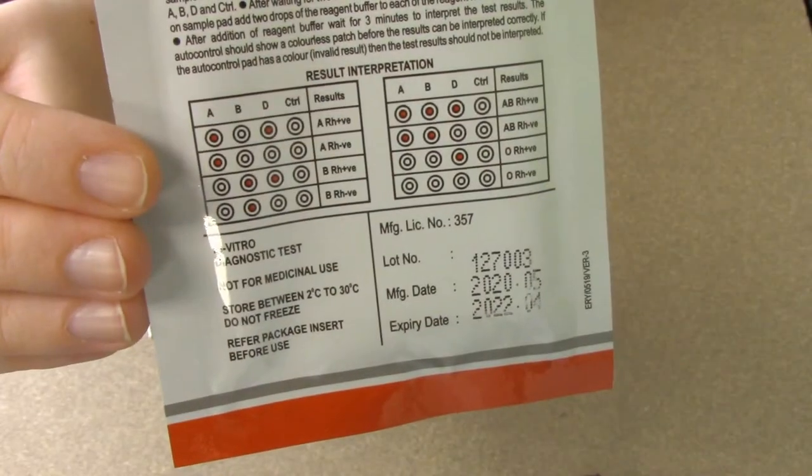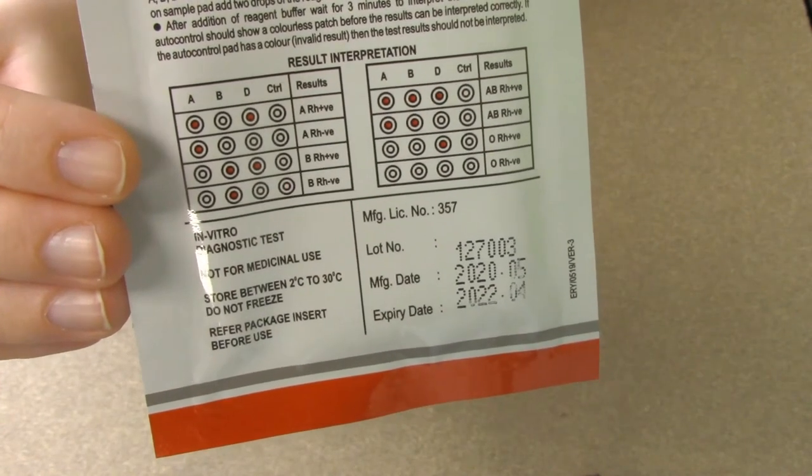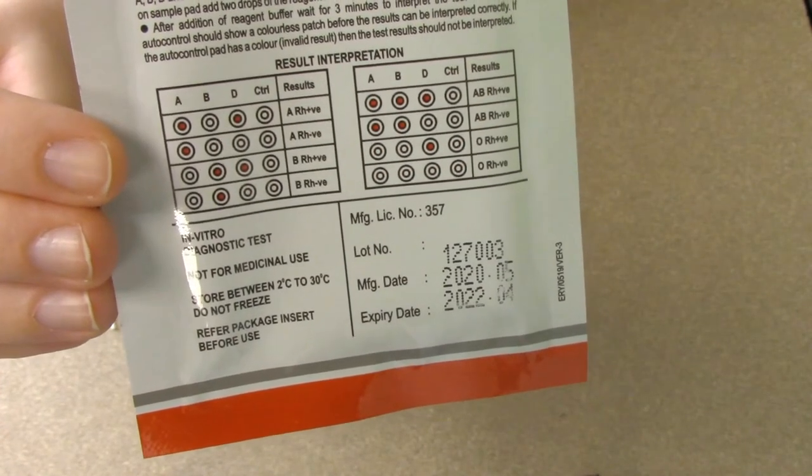For all of the other blood types, you can see what the wells would look like, which ones would remain red, which ones would become colorless.